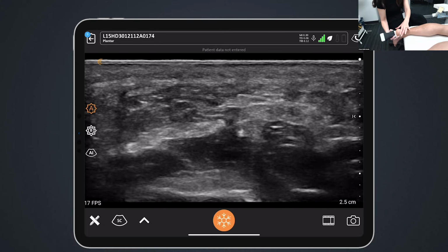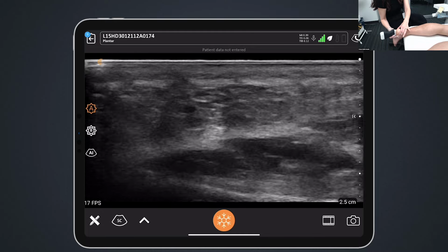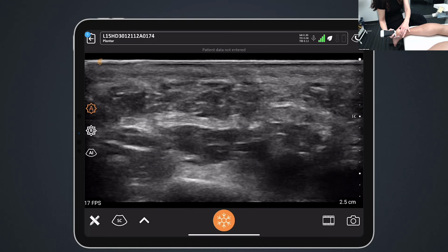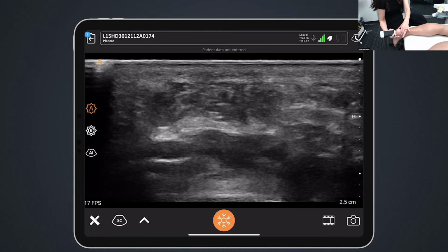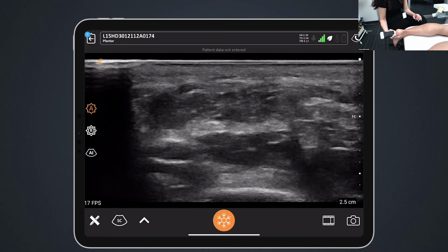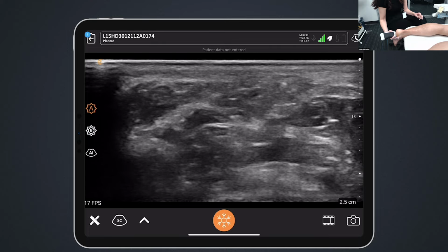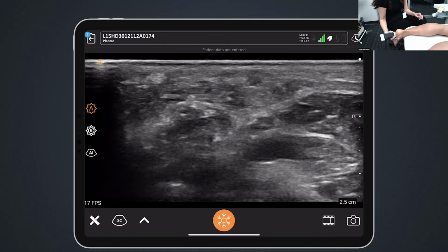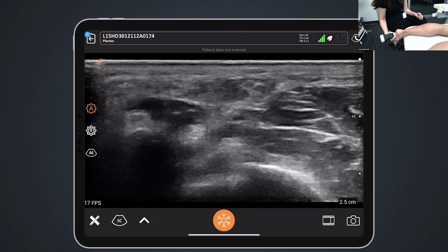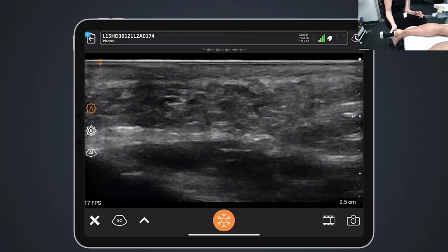Another thing that we can do to delineate the plantar fascia is if you squeeze the heel, you can kind of see that fat pad slide off of that echogenic plantar fascia there, and you can see the borders really well as you go down in transverse. It expands out and thins into those transverse metatarsal ligaments as we move down the arch of the foot. So there we have it.